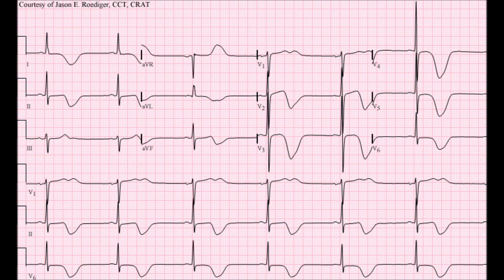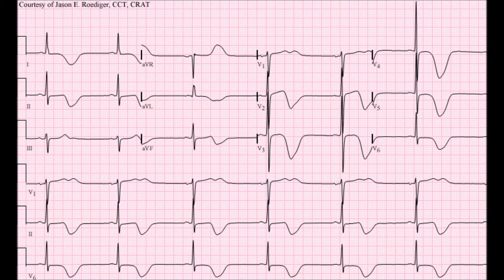Let's take a look at an ECG where you can see some of these global T wave inversions, also colloquially known as stroke waves. If you take a look at the ECG, the first thing that jumps out is this is a bradycardic rhythm, which is consistent with Cushing's reflex.